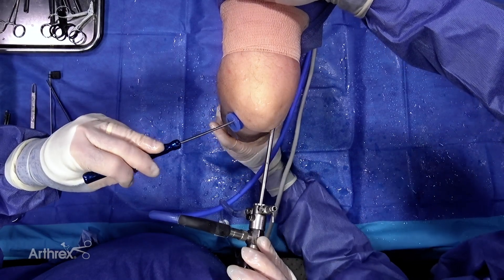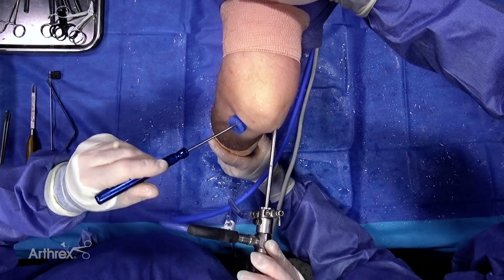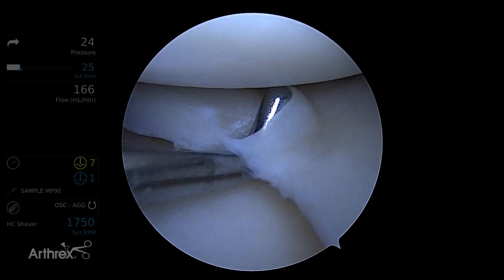Tom DiBerardino here from San Antonio. Here we've got a right knee. We're going to demonstrate a radial tear we often see in a typical athlete.